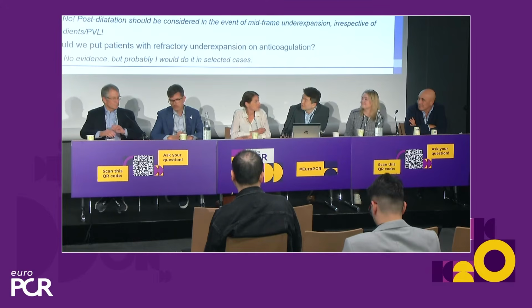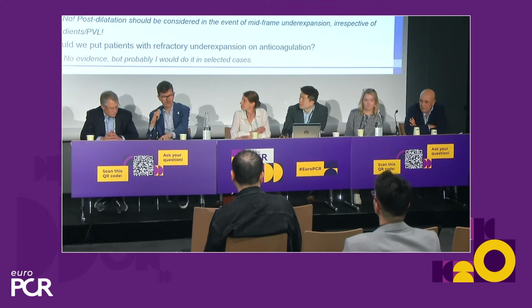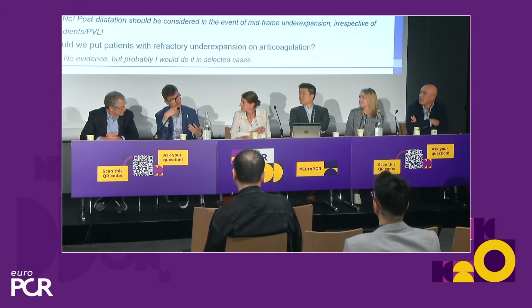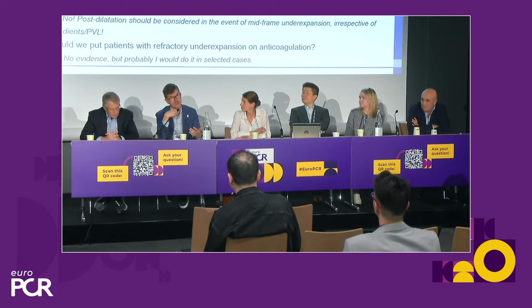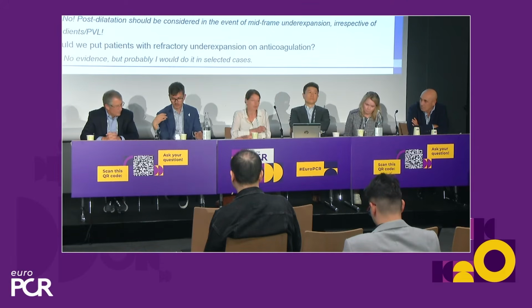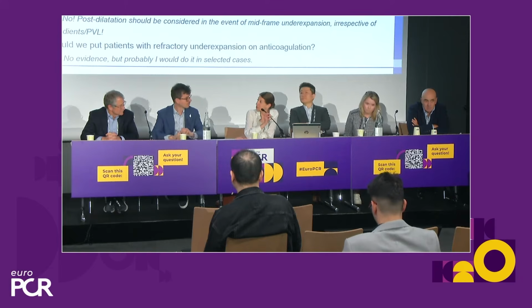I don't know, Andreas, how do you do it? You have a very low threshold for post-dilatation, right? Yes, practically speaking, after you release the valve, you have the fluoroscopy in front of you. So if you already fulfill one of the criteria to post-dilate just by looking at the valve, you just do it, and then you can measure later and do your echo, contrast injection, pressure gradient, etc. Most of the time you're done, because you post-dilate with the size you want to use, and then you know that you've done what is recommended. So that doesn't add much time to the procedure. It's definitely a more streamlined procedure as well.